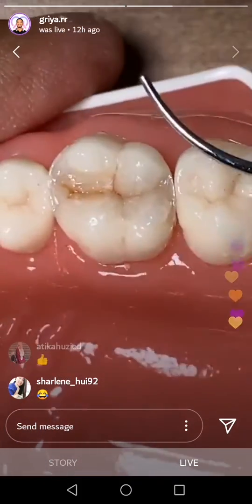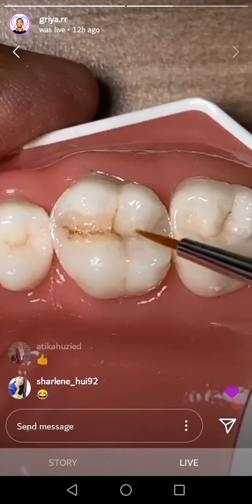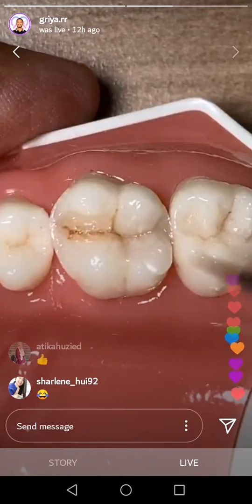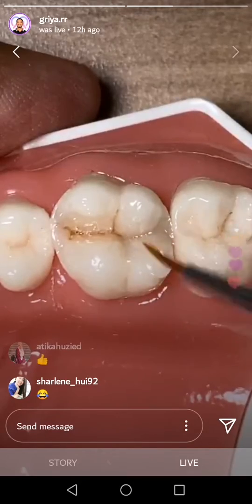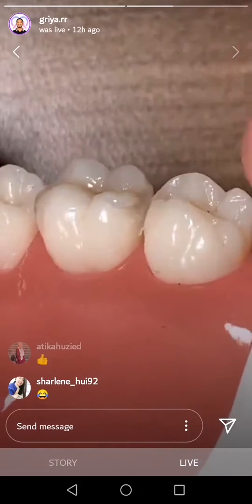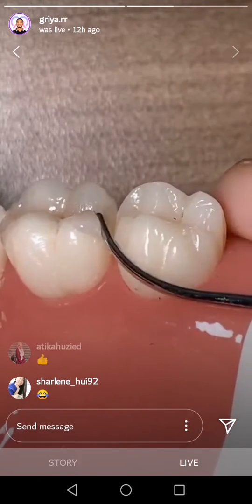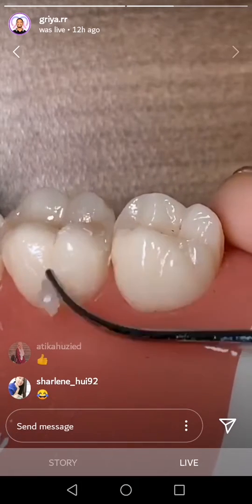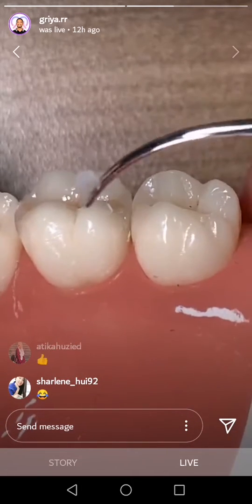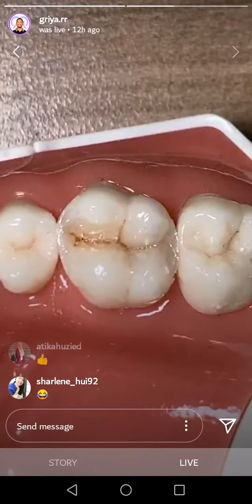Because after this, I want to remove all the excess, ya. Jadi, kelebihannya dibuang. Okay, so I will remove the excess. Like this, yeah. If you want to see how to remove it, like this. See? Oh my god. Very easy, right?